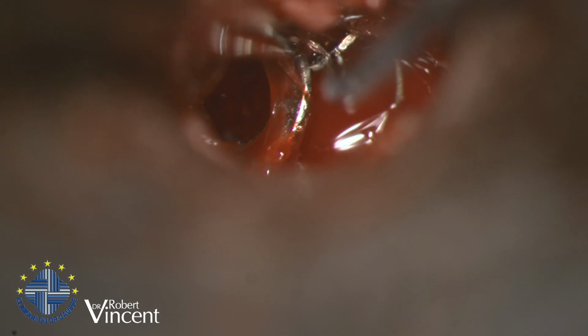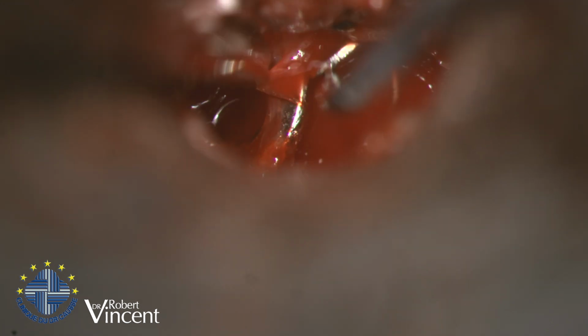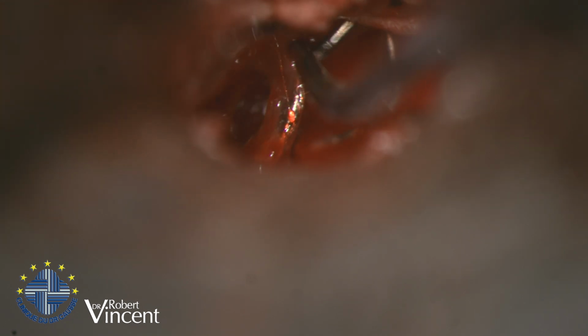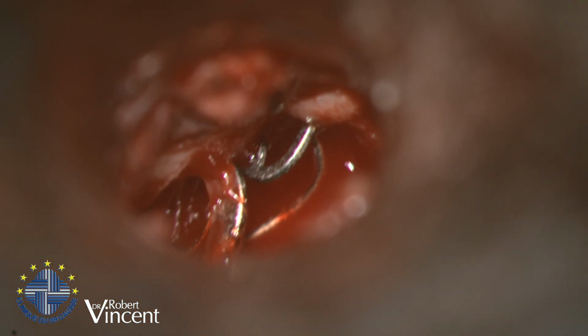Looks like there are two prostheses, by the way. This one plus this one. So I don't know. Very strange. Yeah, I should have removed the previous one, I think. Very strange. I don't think there is any residual malleus.